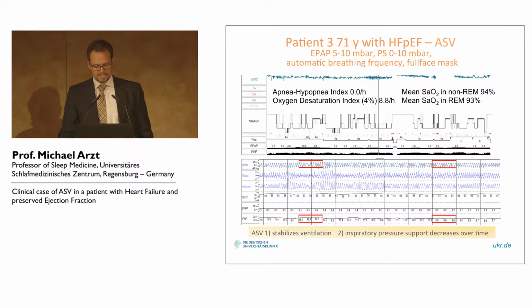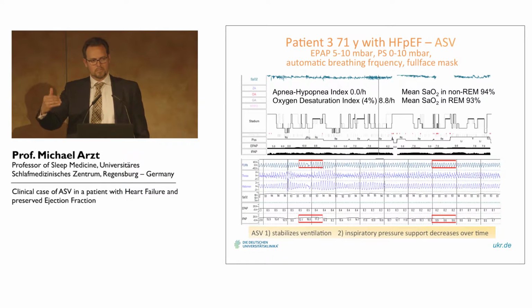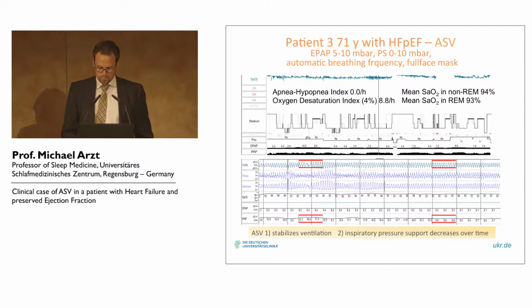It really stabilizes ventilation. So ideally, when you have a decrescendo, crescendo in tidal volume, the inspiratory pressure support increases, so anti-cyclic, and if it works, the algorithm has to apply less and less inspiratory pressure support. We observed this also over time, looking over 3 months. After a while, when you read the machine readout, the inspiratory pressure support usually goes down over time.